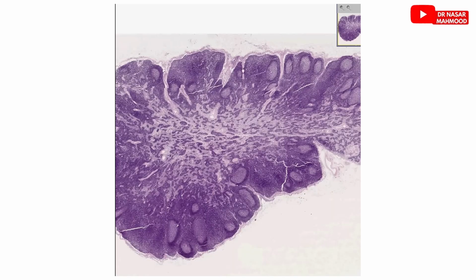Now, that's the classical histological slide of a lymph node. Let's move on to the next slide.